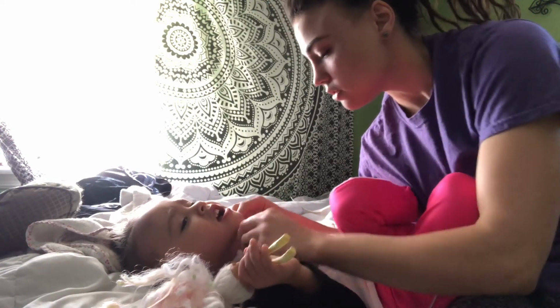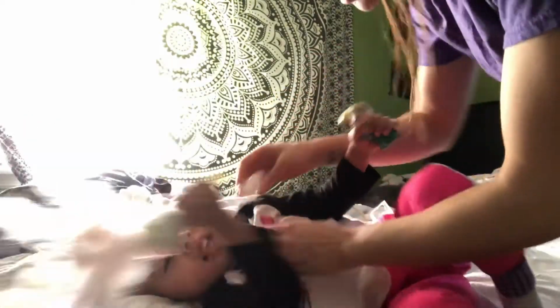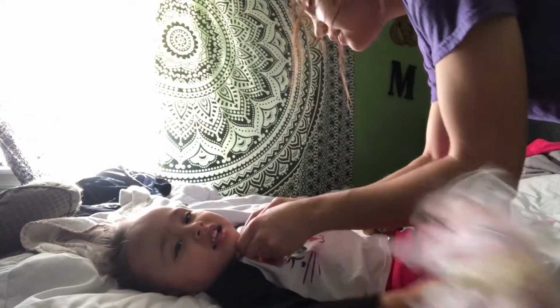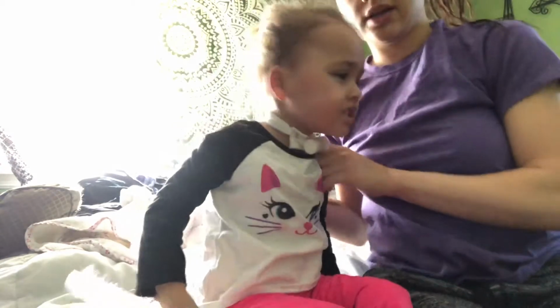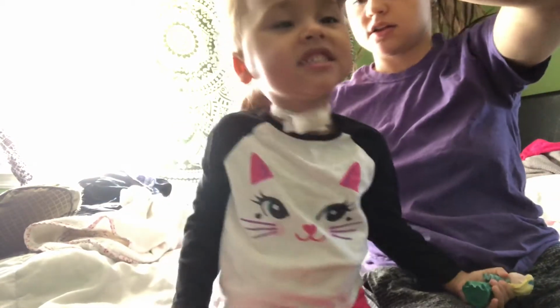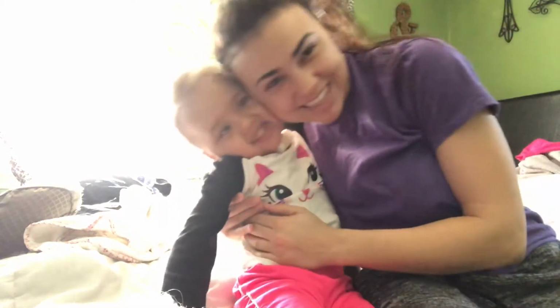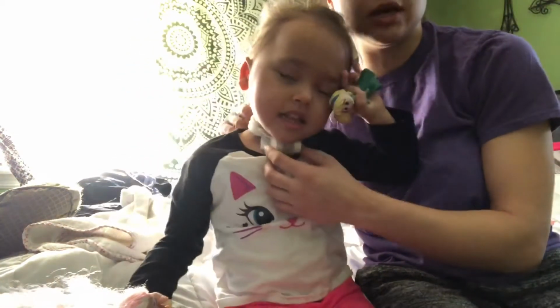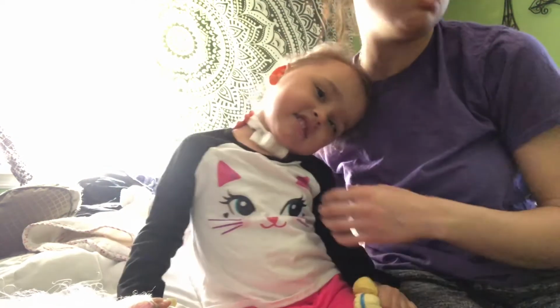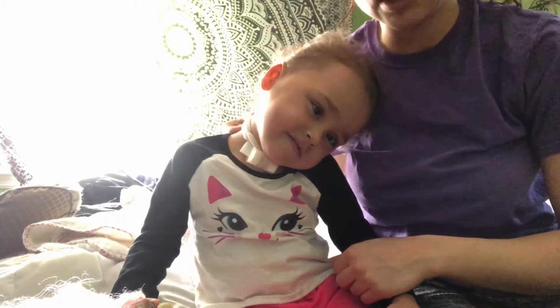All right, then you just fix the gauze, pop on the HME. Hold on. And we're done. Put one finger in the back behind her neck to make sure it's comfortable on her. But you don't want it to be able to move the trach out of place, or if she moves her head, it shouldn't be loose. It should just be comfortable and snug.